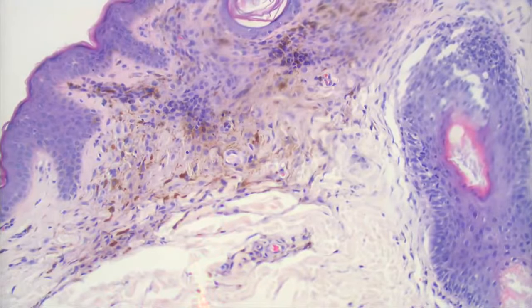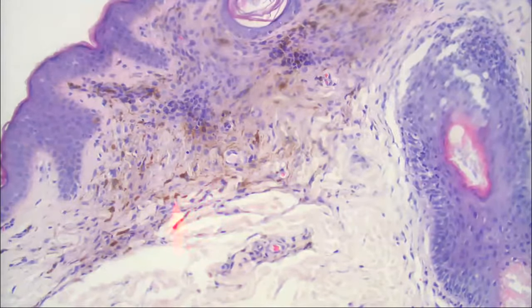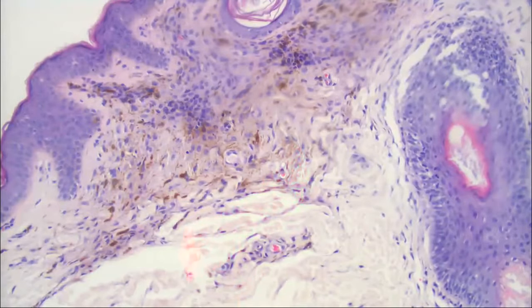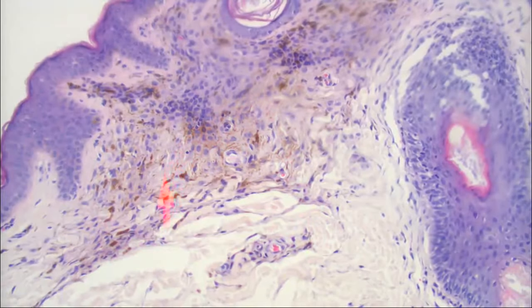Spindle cell? A spindle cell? These are not truly spindle cells. They're kind of elongated with these fine little tentacles that stick out. What do we call that? Anybody know? Like the dendrites. Dendritic, excellent. Dendritic is one type of melanocyte: small round, large round, pagetoid, balloon, oval, spindle, multinucleated, dendritic.